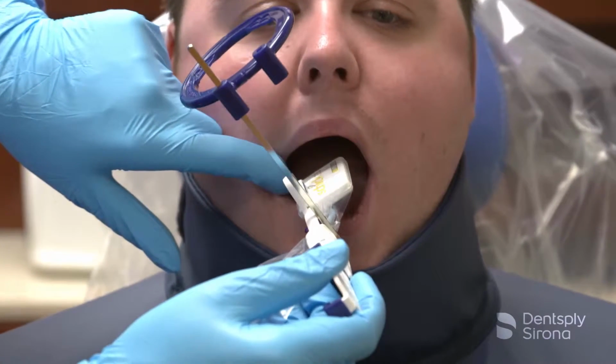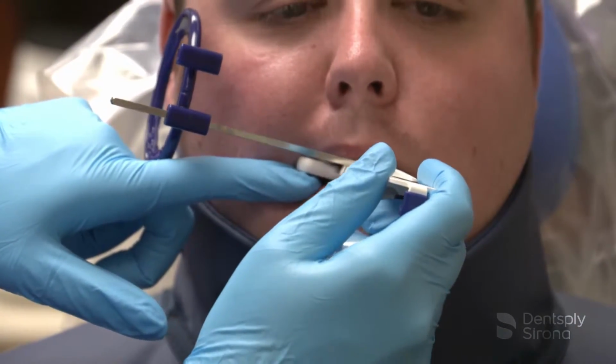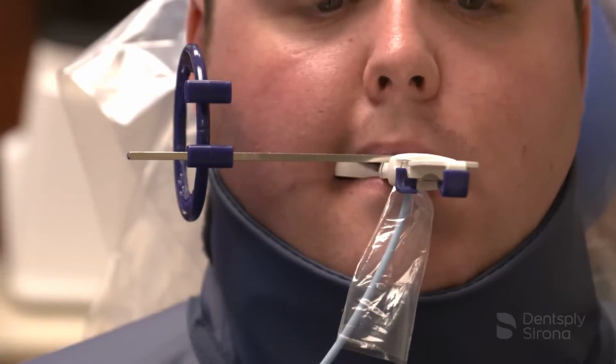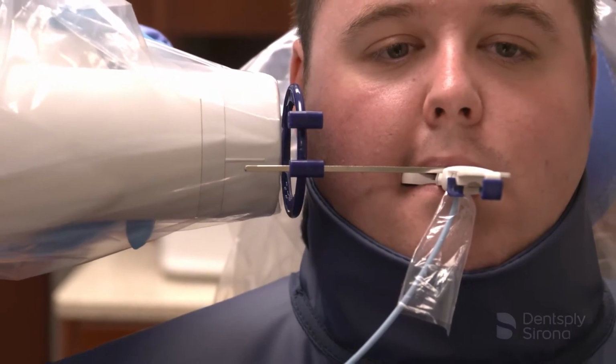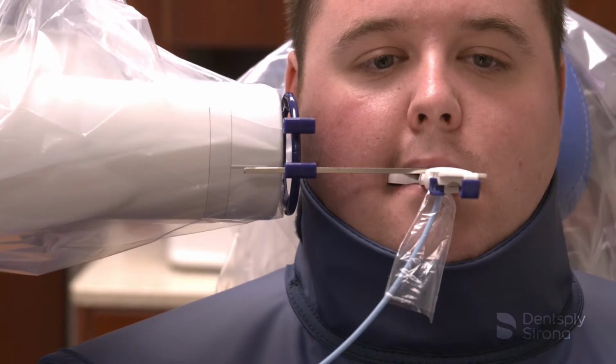Gently place the sensor behind the endodontic treatment area and have the patient close slowly. Utilize the purple guide to help align the PID edge so that the clinician avoids horizontal angulation errors. The clinician should be careful of the cord and often can place the cord behind the canine and premolar to avoid unnecessary damage.